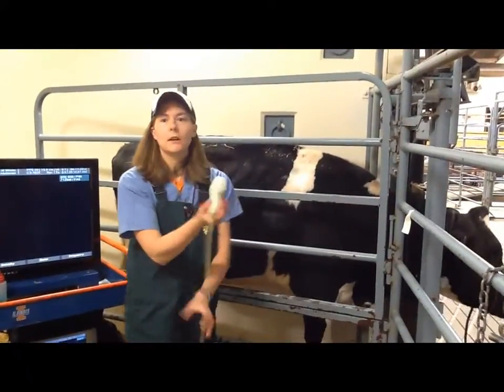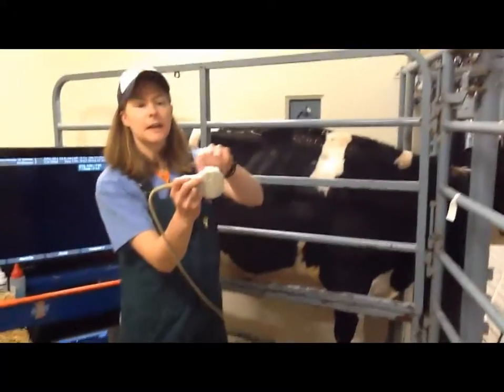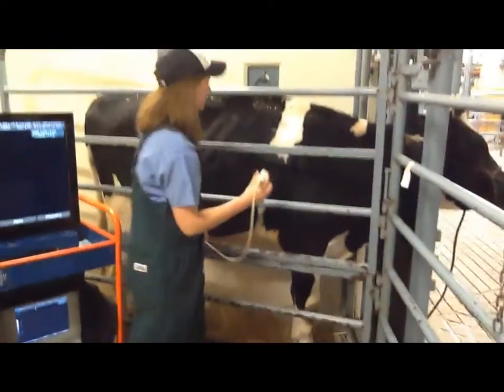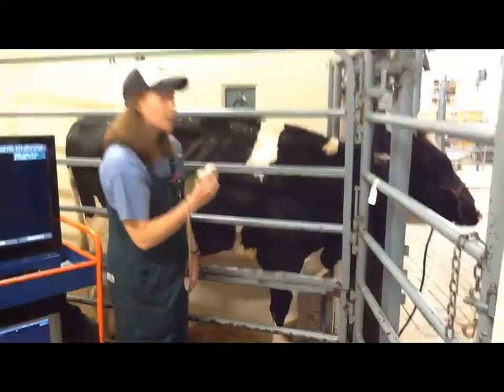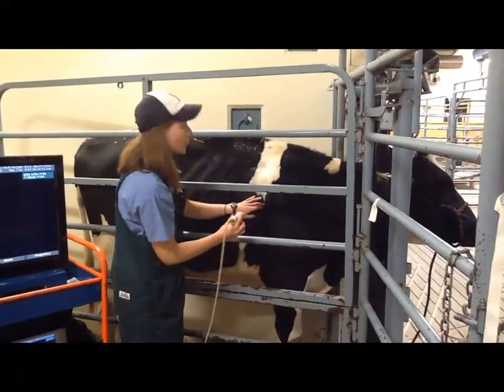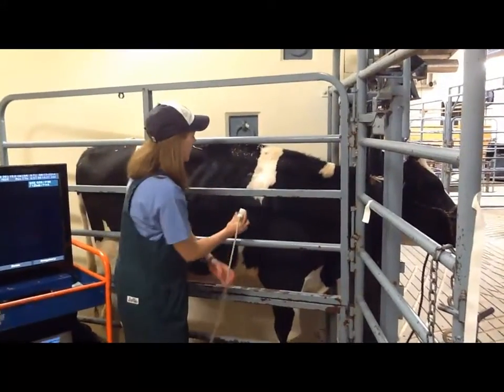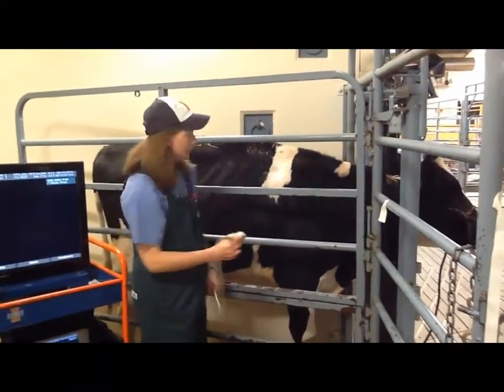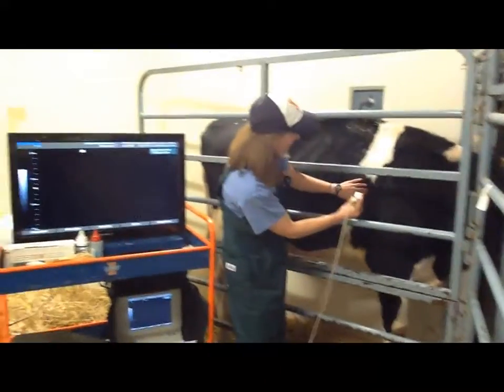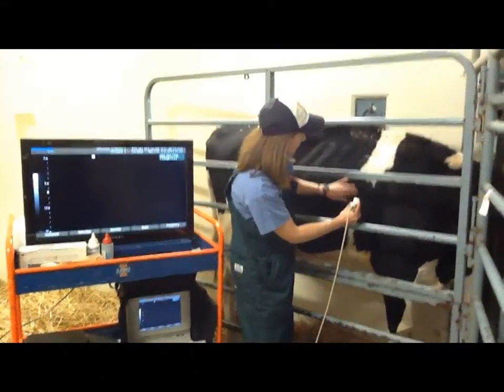This is your ultrasound probe. See this little line here — you want to hold it like so. A key tip: you want to go in between the ribs. You don't want to go on the ribs, as you won't get a very good picture on your ultrasound screen. So you may want to palpate for a rib first.